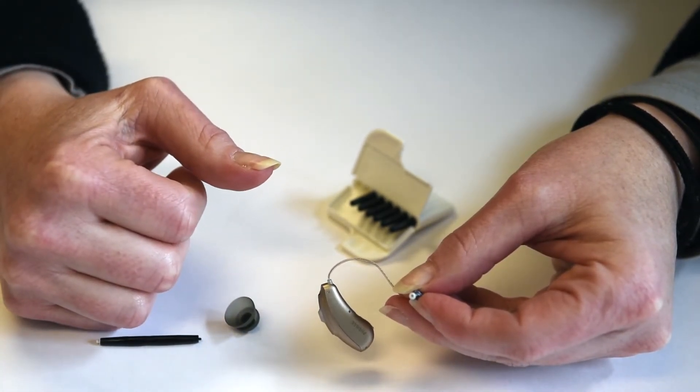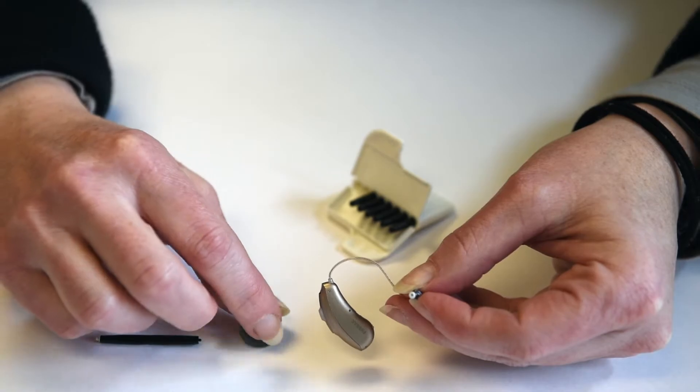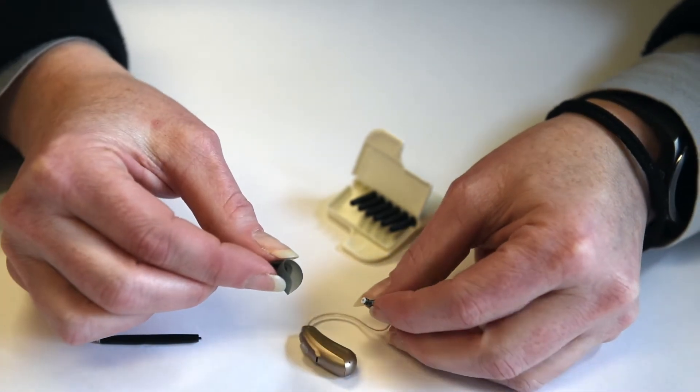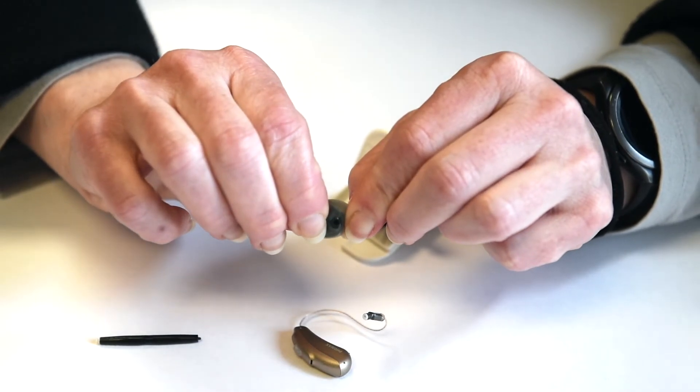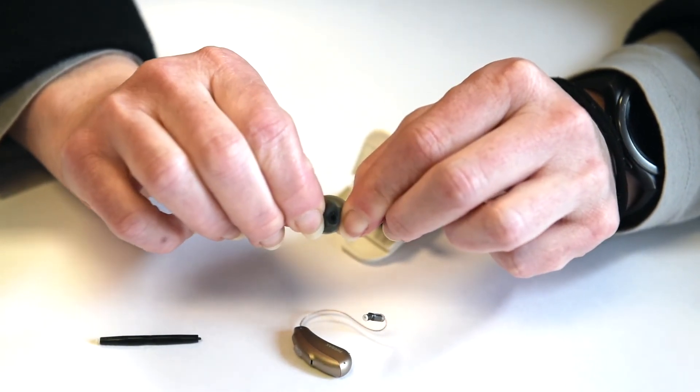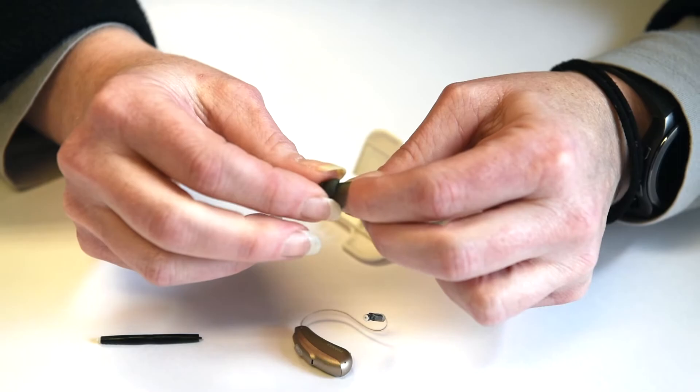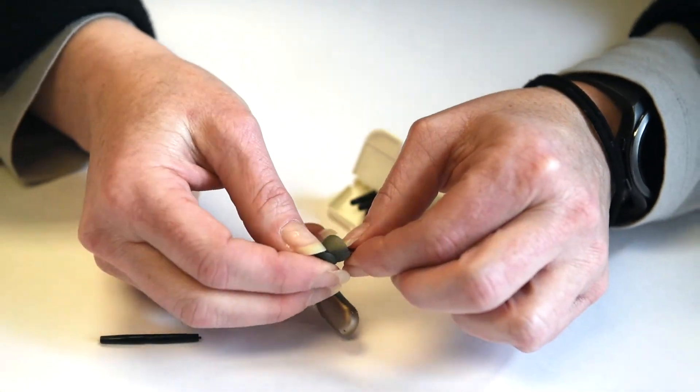The last thing we need to do is just put the rubber tip back on. It's hard to see, but if you look inside, there's actually a little hole there. You're going to fit that over the end of the hearing aid.